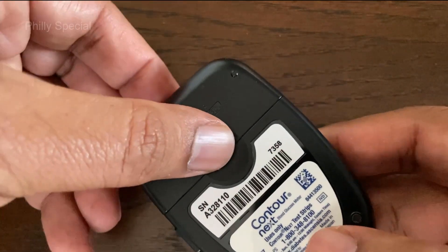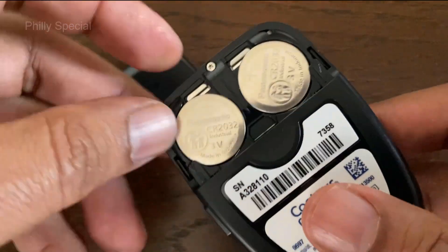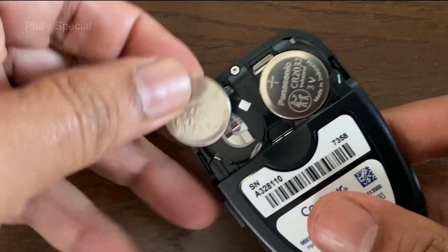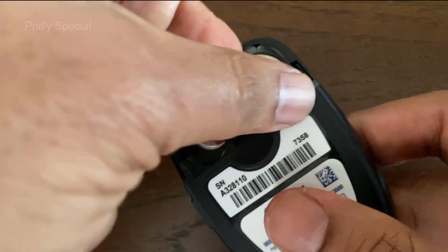Press firmly on the battery cover and slide it out of the meter. Remove the old batteries by prying from the top side of the battery, and replace with two 3-volt CR2032 coin cell batteries.